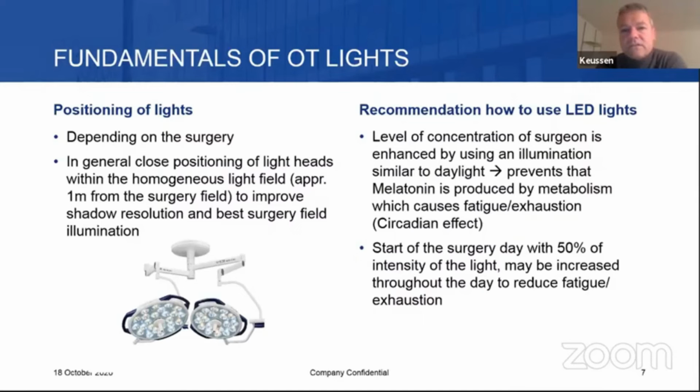So our recommendation is to start the surgery of the day with about 50% of the intensity of the light only, because you will see, and that's probably what you encounter in your experience too, that you increase the intensity throughout the day. This definitely also reduces fatigue and exhaustion. So start lower and then you can ramp up during the day.